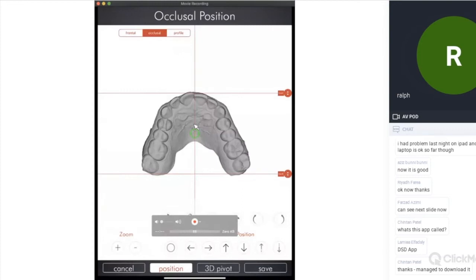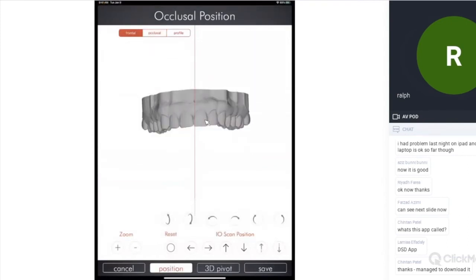That's one important thing. The second important thing is, if we prep my teeth and rescan again, the only way to calibrate the original scan and the prep is to use the palatal area. That's like a fingerprint. In all scans, this palatal area is going to stay the same. Now I don't have any references to calibrate the teeth because they are changed, but the palatal area is the same. So I'm going to exchange the original scan with the prep, and then I adjust my design to the prep. So let me go, for example, and show you frontal.